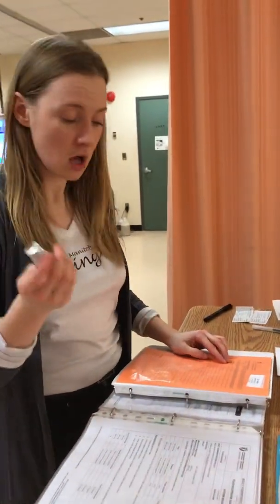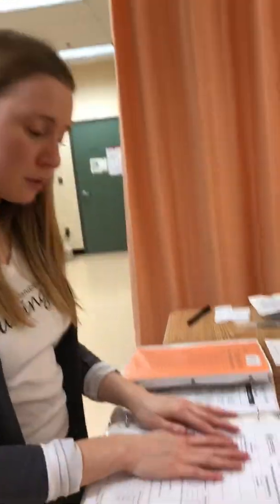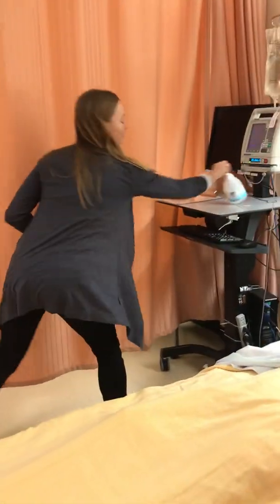I'll show the calculations later. It's an IV route. I know my patient has an IV and it's given every 2 hours via CIVA. The time is now. I will be giving the medication as soon as I'm done preparing it. Okay, so that's my first check done. The second thing I would do is look at the drug monograph. Oh, also perform hand hygiene.